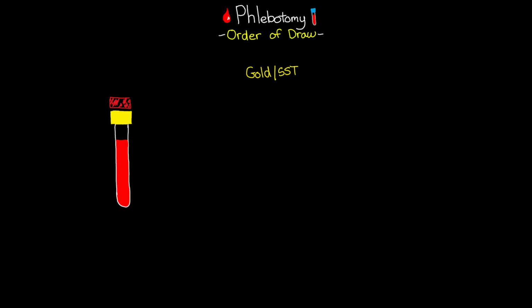And again, this tube can be used for a whole host of different chemistries. But again, this isn't the common tube that we typically will use. And more often than not, these are going to be our send-out tubes. And typically here, they're checking for the antigen antibody.